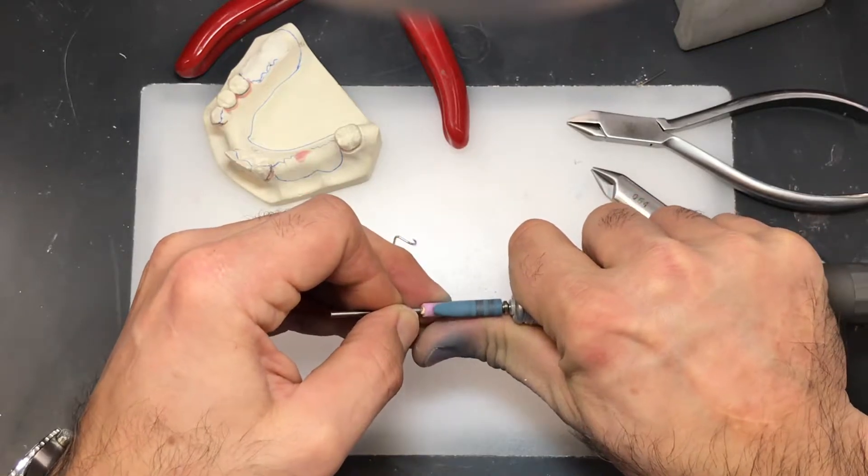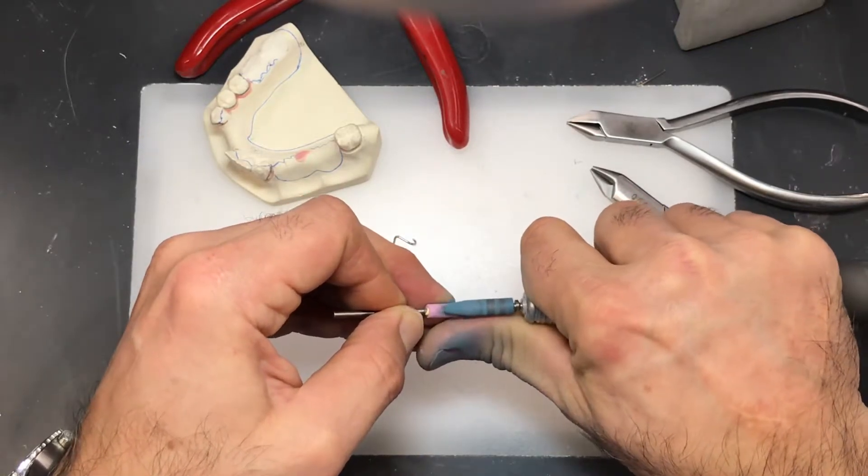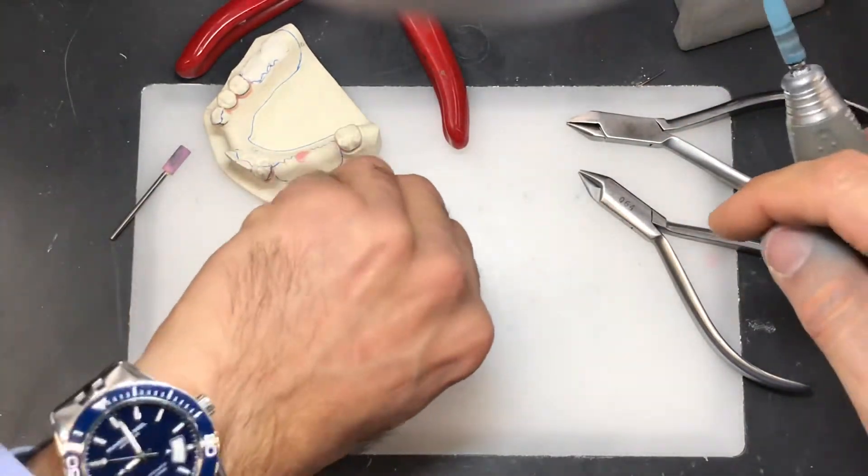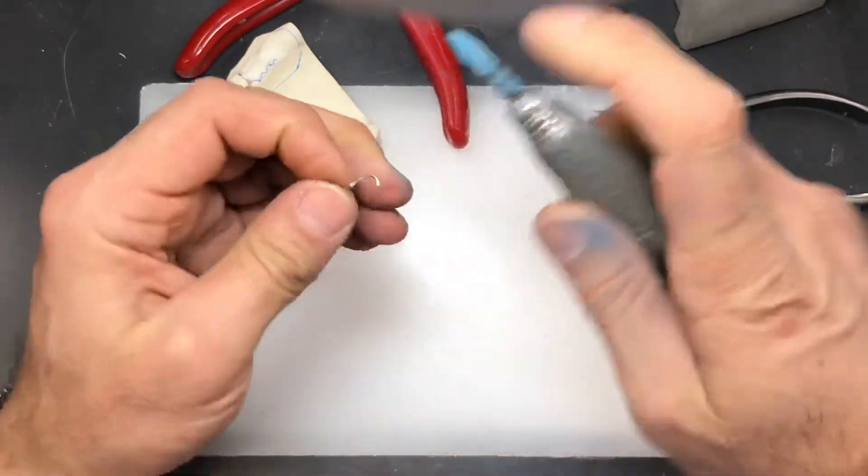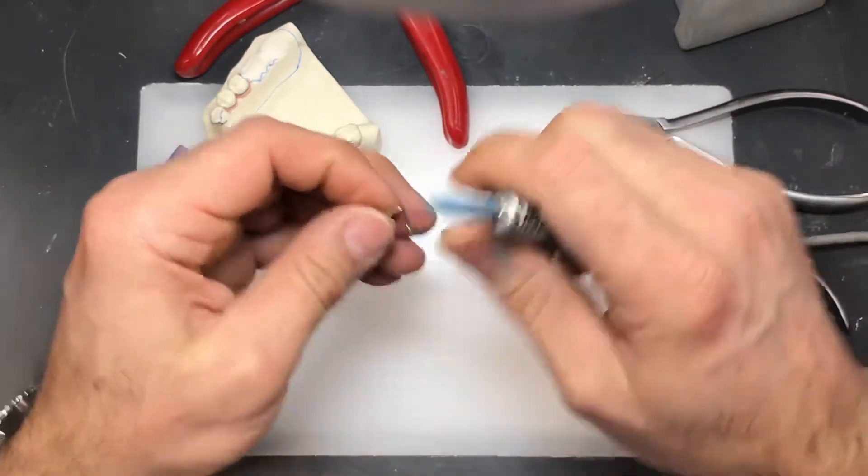Kind of smooth it out a little bit and you can even taper it a little bit so it's a little more ideal of a shape to fit inside the wire.